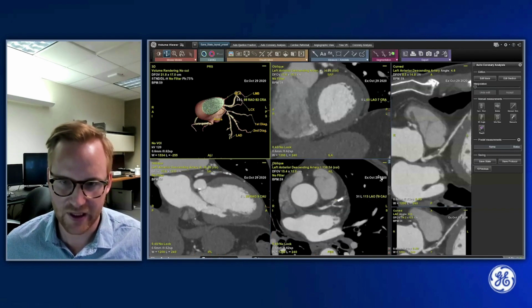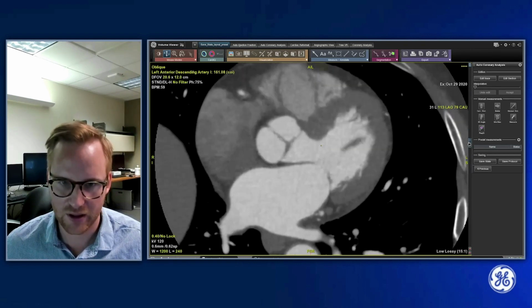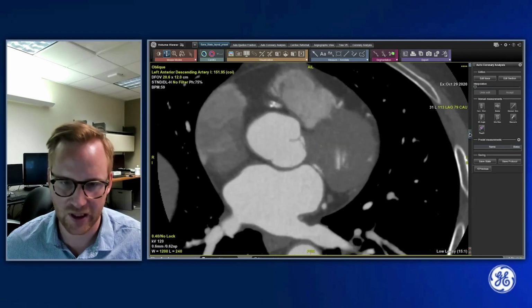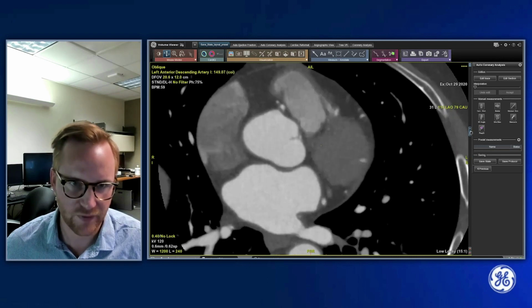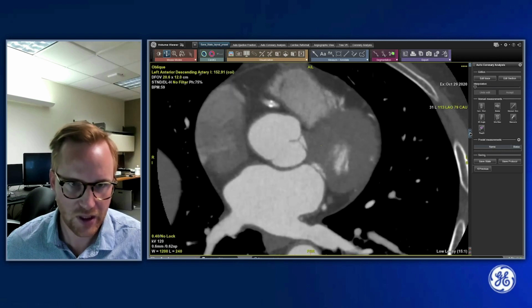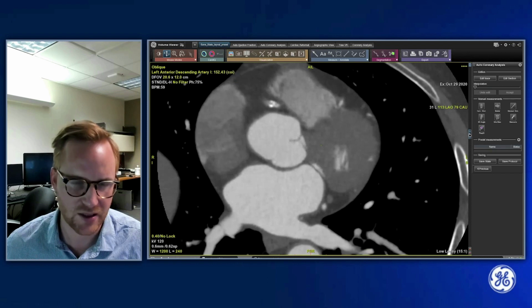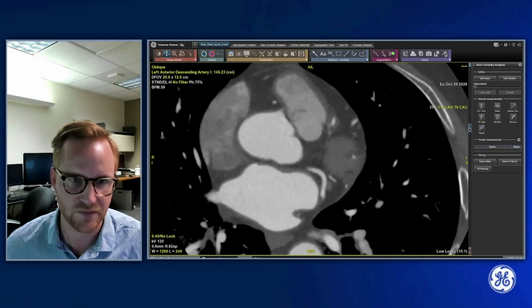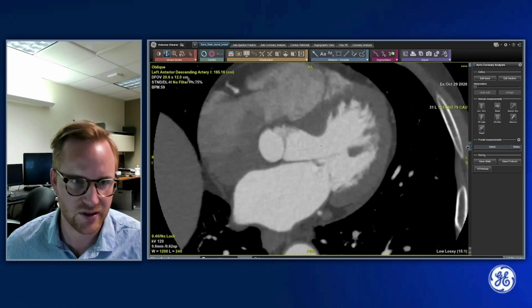Here are the results of his coronary CTA. As you can see, it was a technically adequate study with appropriate opacification of the left-sided heart structures. We'll focus on his coronary arteries. First, the right coronary artery is noted to have a normal origin. There is a focal bend in the ostial-to-proximal section of the vessel, and calcific plaque is noted in the proximal segment without significant stenosis.